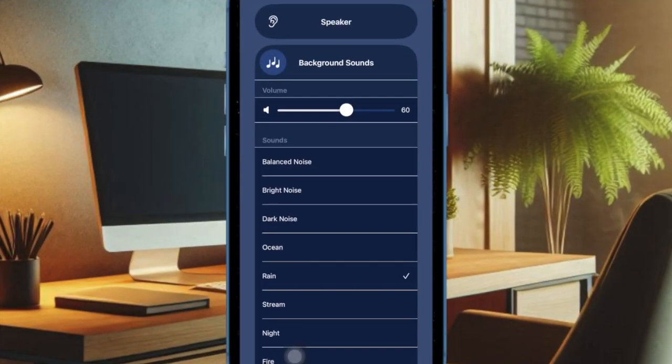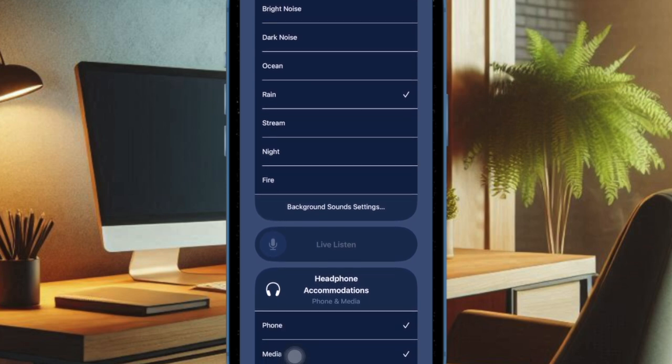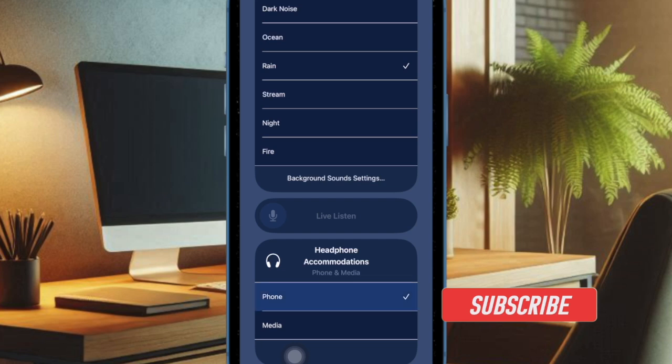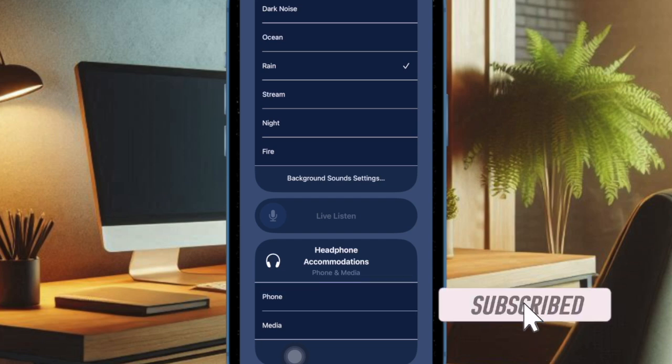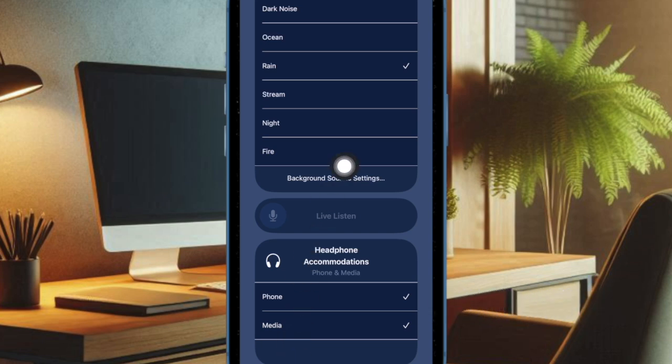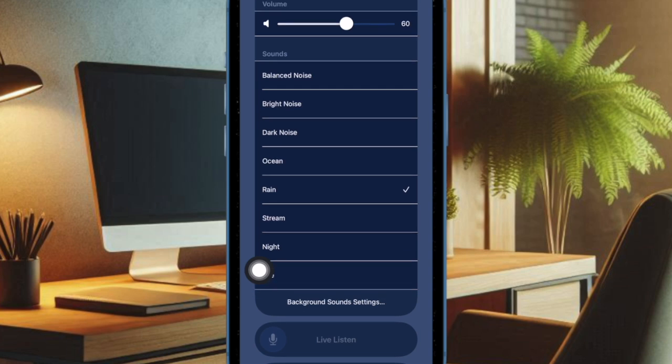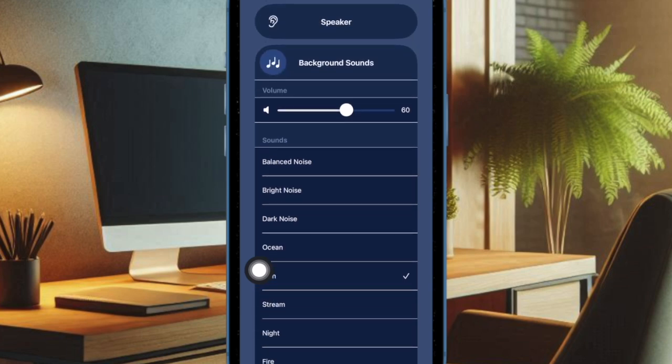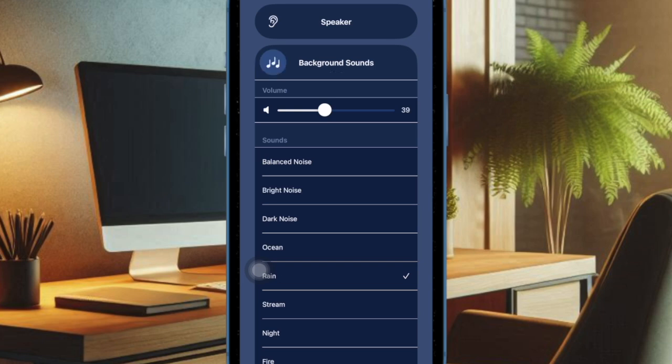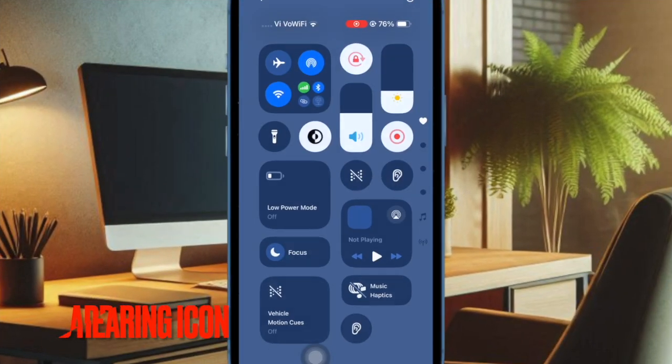Hey everyone, welcome back. In this video, I'll show you how to set up and use the Hearing Control Center on your iPhone. The Hearing Control Center is a powerful tool for managing audio and accessibility features like Live Listen, Headphone Accommodations, Background Sounds, and more. Let's get started. Before using the hearing features, you need to first add the hearing option to your iPhone Control Center.